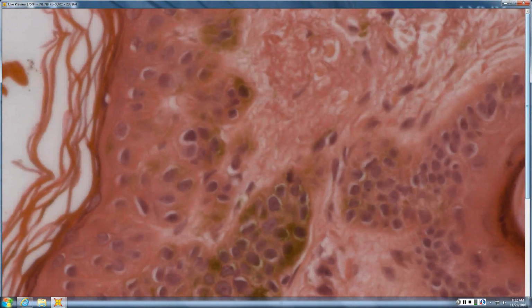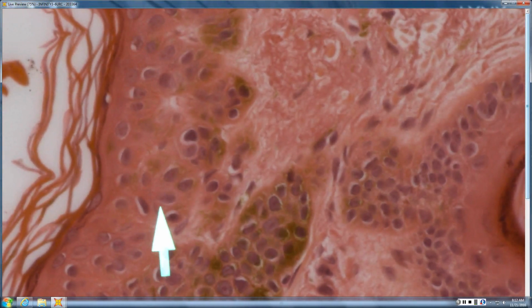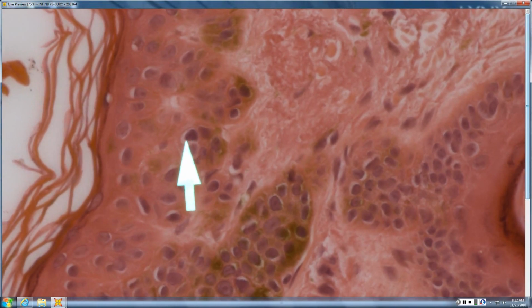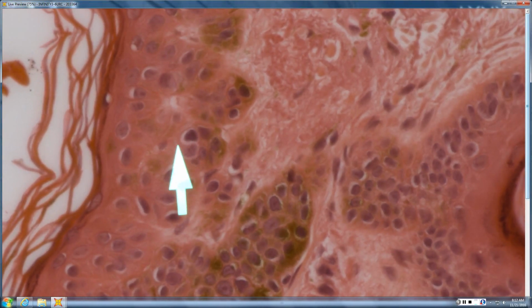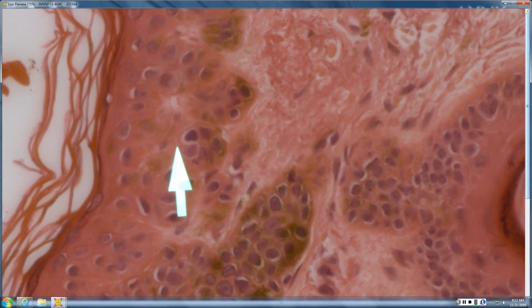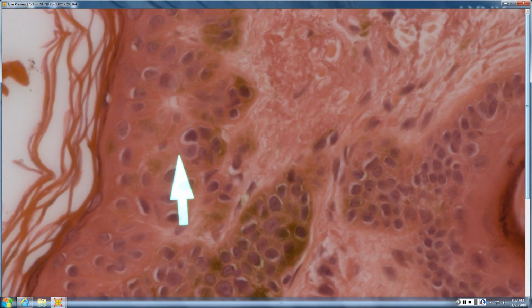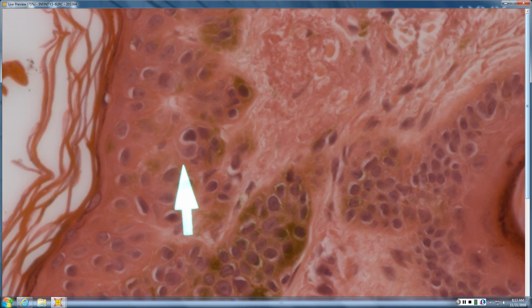If you see a nucleus, then a vacuole, then cytoplasm, that's a keratinocyte. If it were a melanocyte, it would be nucleus, then cytoplasm, then the vacuole. So if it's nucleus, halo, cytoplasm, that's a keratinocyte. So the things that look pagetoid are all keratinocytes.